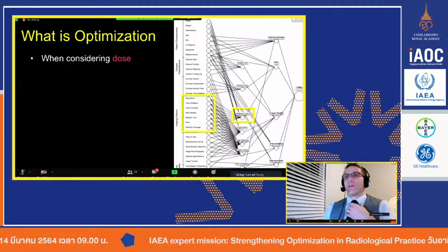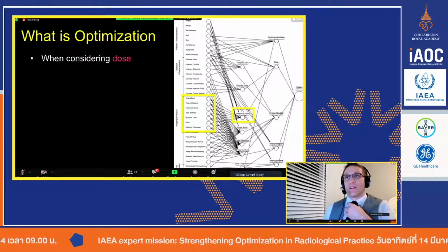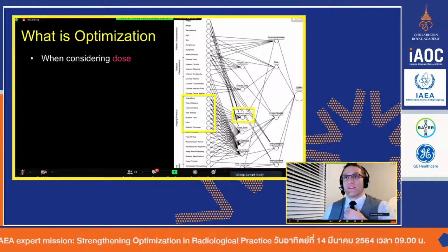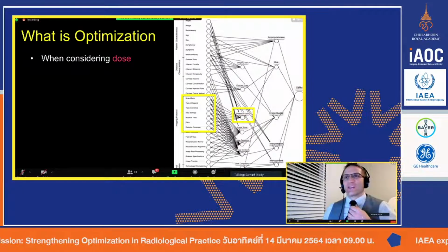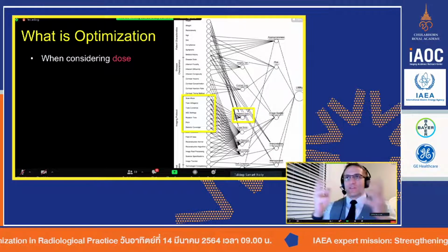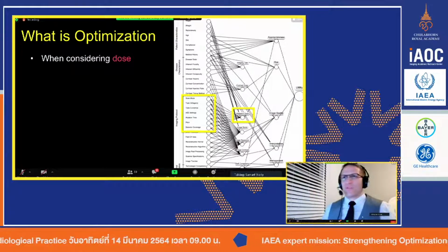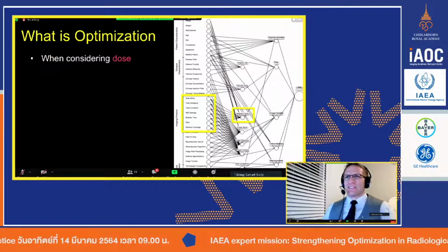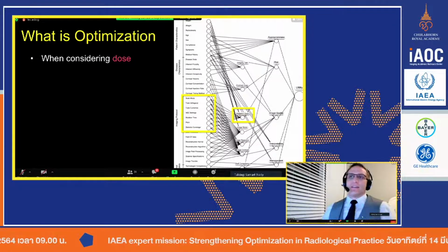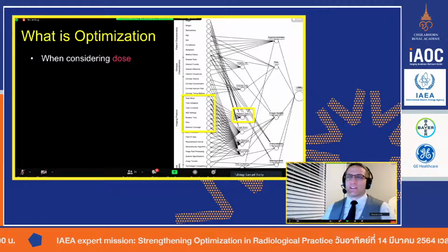And so our biggest complaint from our radiologist was really C6 or C5 through C7. When they looked at it, the borders of the vertebrae were almost translucent and at times almost gone just because of the noise content. And so anyway, that's my biggest suggestion.